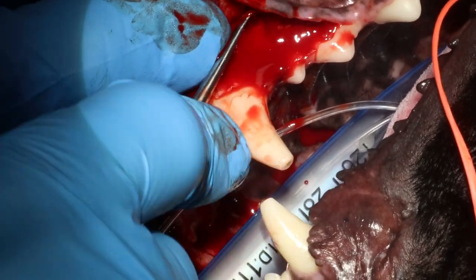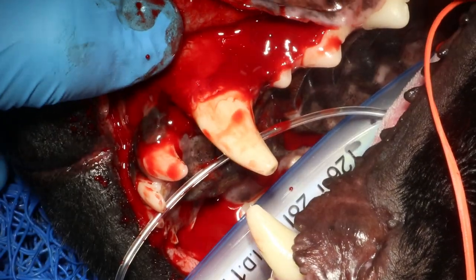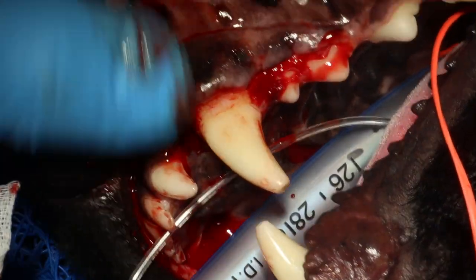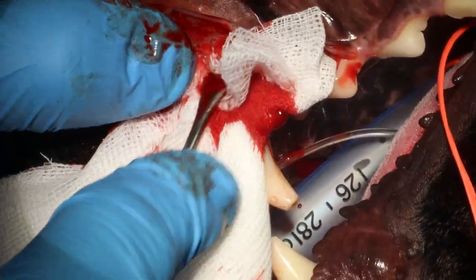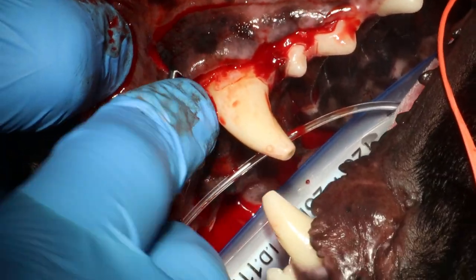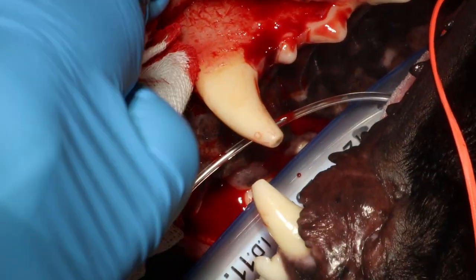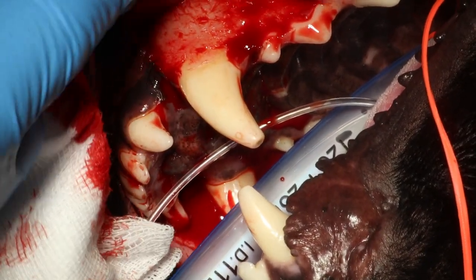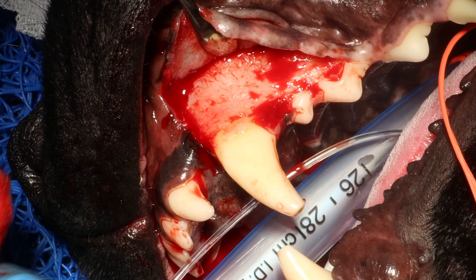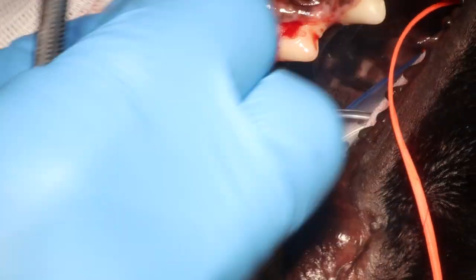Now I'm getting a nice exposure. Don't worry about the infraorbital nerve and artery — it will move away with the flap. If you scrape against the bone it will stay within the flap, so you will not damage it. Now I have the nice bone exposed and there are some bony changes here because there's a chronic periapical problem, likely creating a cyst in this tooth.